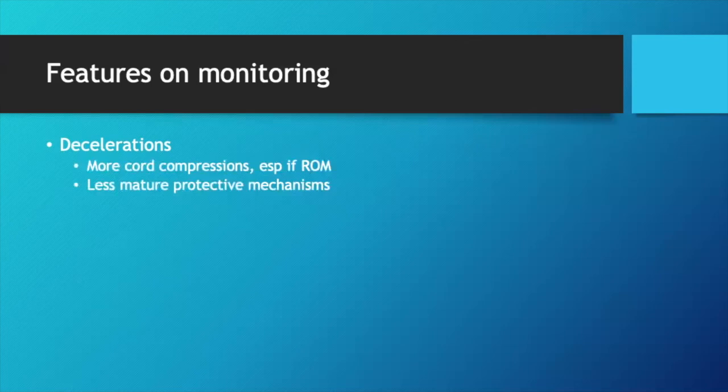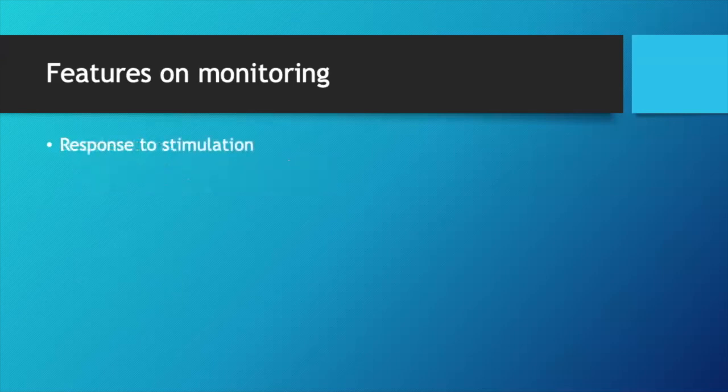If she's in labor and the baby's cord is getting compressed with every contraction, there are going to be decelerations, but they're not necessarily going to be as impressive. They don't have to be as deep because the baby doesn't have a fully mature parasympathetic system as yet. So they may still be recurrent, but they're not as fully developed. All of this makes monitoring the preterm baby a little bit more difficult. You need to make sure that you understand what's supposed to be happening. We said that the baby's baseline is a little bit higher, the responses are not very well developed, and the cycling is iffy. It's not the same as a term baby, and it's not going to respond the same way, in terms of how much it can raise the baseline.